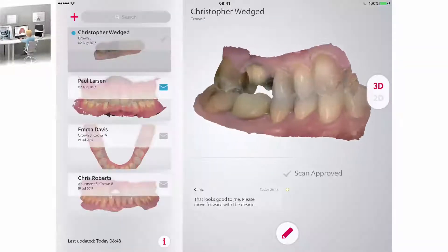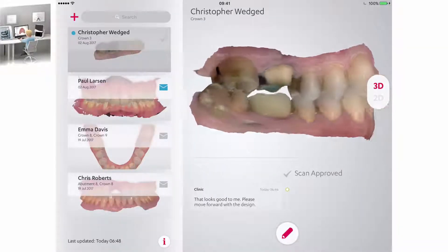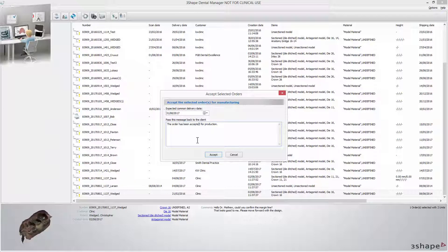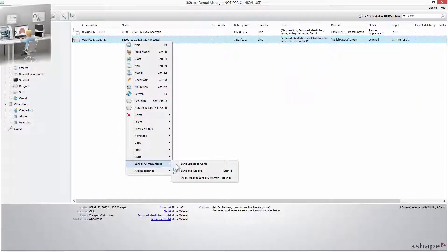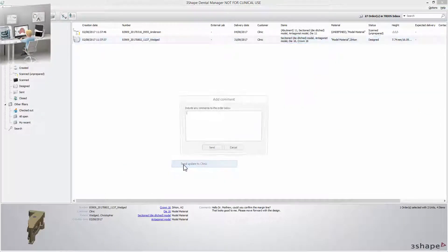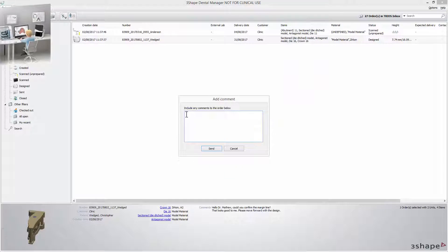The technician, after reading the comment, can accept the case for design in the TRIOS inbox in the dental system. When a design is finished, it should be sent for approval via Communicate. Comments can also be added at this stage.